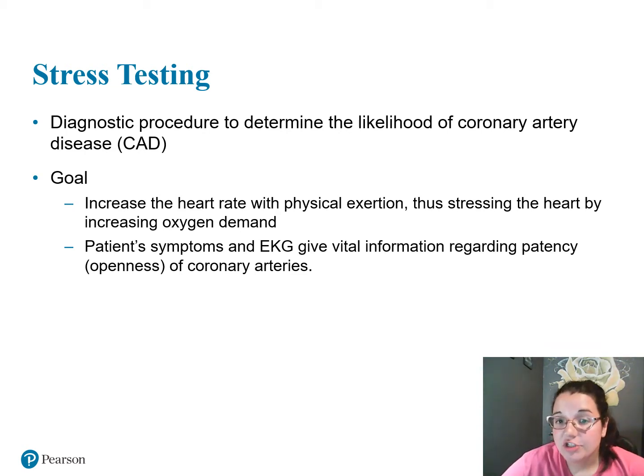The goal of your stress test is to increase the heart's rate with physical exertion, thus stressing the heart by increasing oxygen demand. Think about it. If you've ever gone for a jog, or had to run after your 2-year-old, or run to catch something from falling on the ground, you're out of breath, right? You're stressed out. You're stressing your body, and you're increasing your oxygen demand. This is the goal of a stress test.